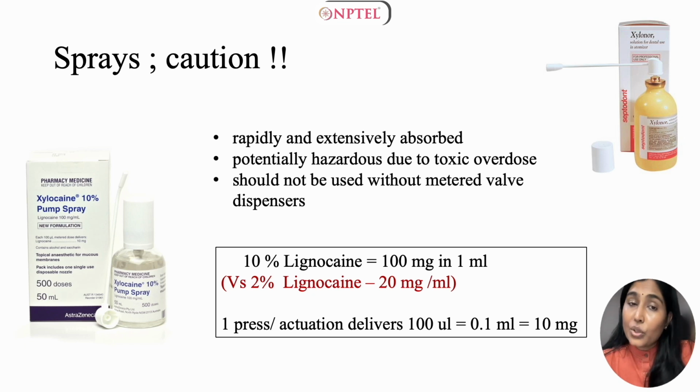On this aspect, gels are safer. Additionally, the area covered by gel can be more specific as compared to a spray. A very important point to note while using sprays is to use a metered valve dispenser, which is much more controlled in delivery.